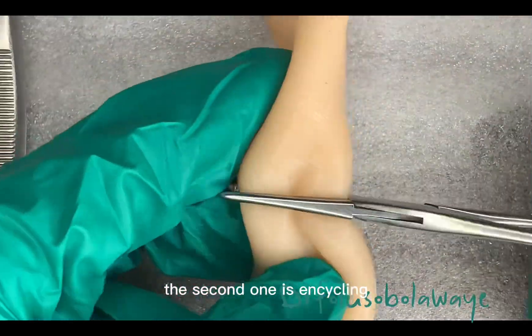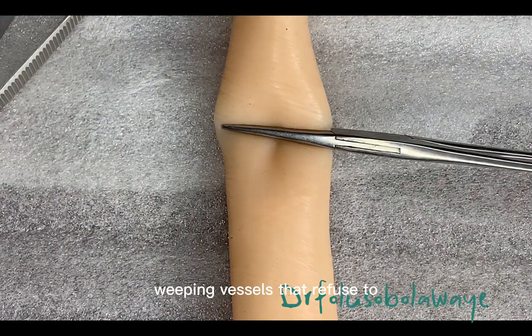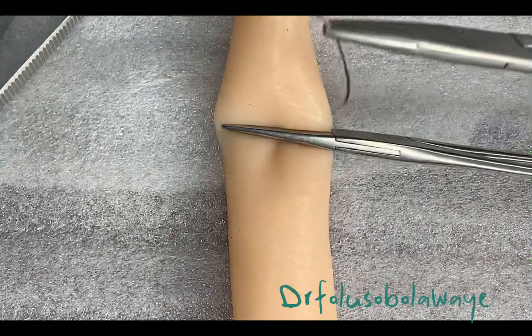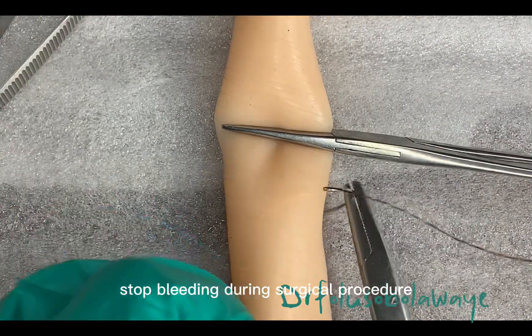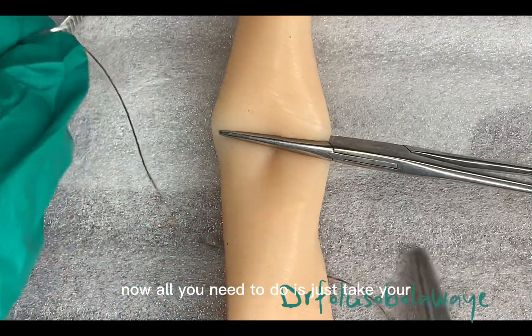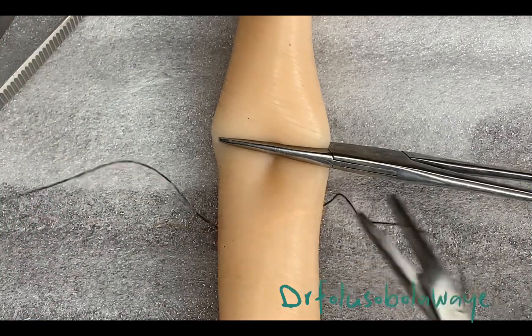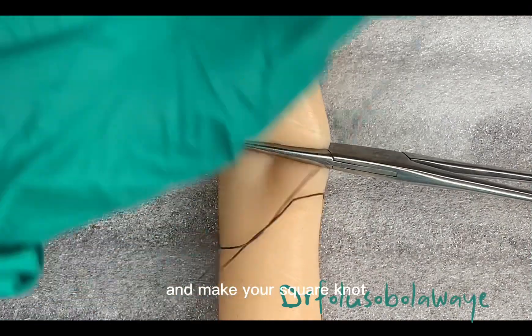The second one is encircling. Encircling can actually be applied on small bleeding vessels that refuse to stop bleeding during a surgical procedure. All you need to do is just to take your suture material around that particular hollow vessel and make your square knot once this is done.